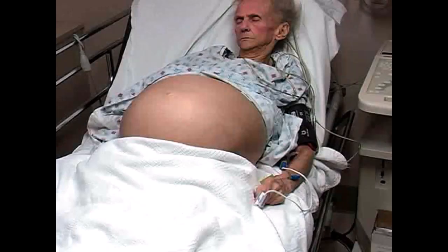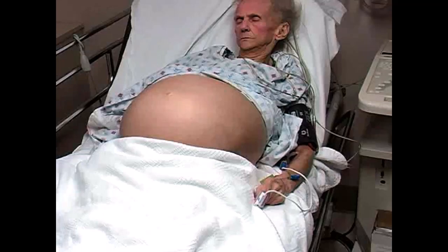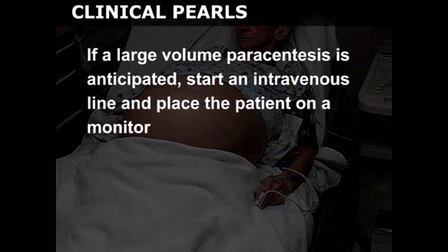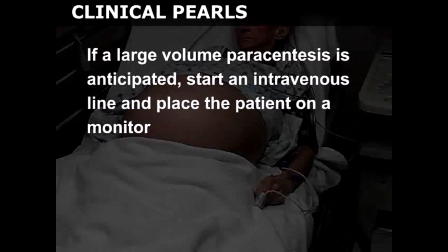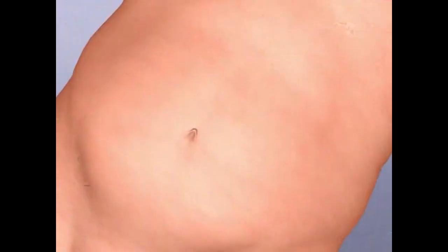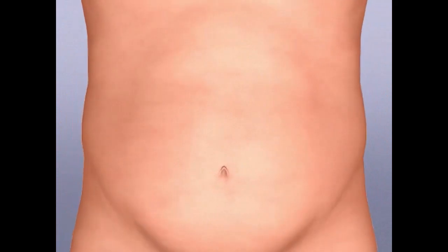Position the patient supine in the bed with the head slightly elevated. If a large volume paracentesis is anticipated, start an intravenous line and place the patient on a monitor. Several different anatomic approaches may be utilized for abdominal paracentesis.